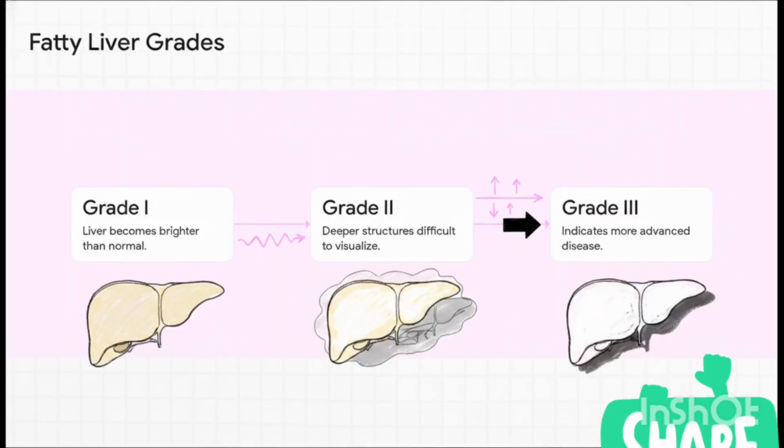But here's the thing. Fatty liver isn't just a simple binary yes or no. It stacks progressively.